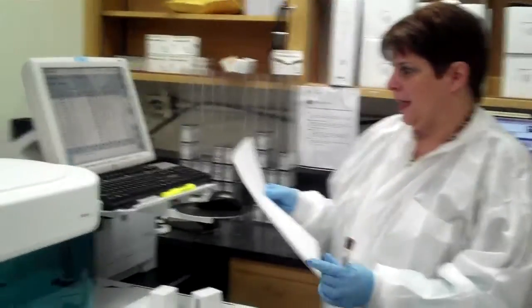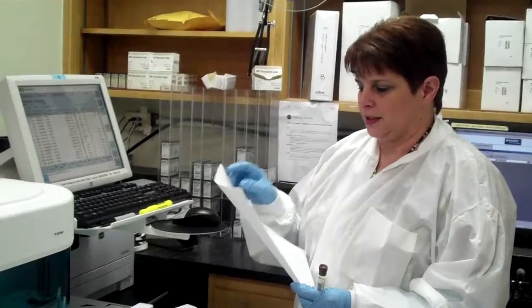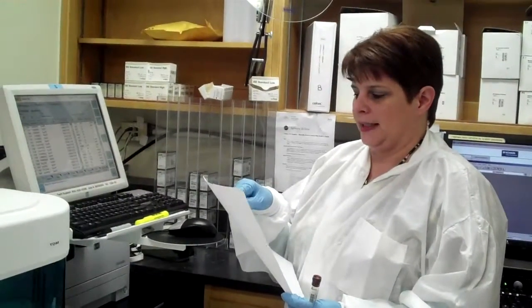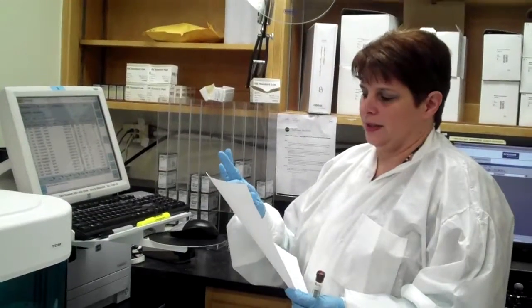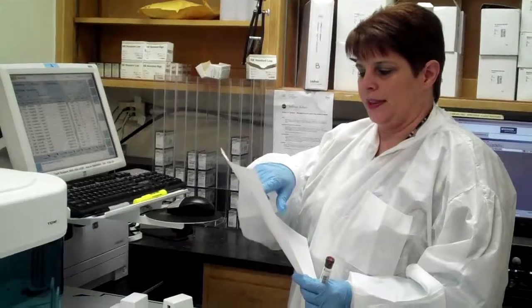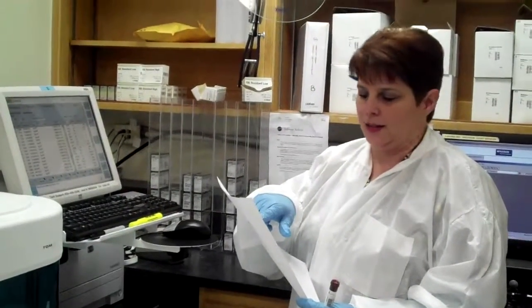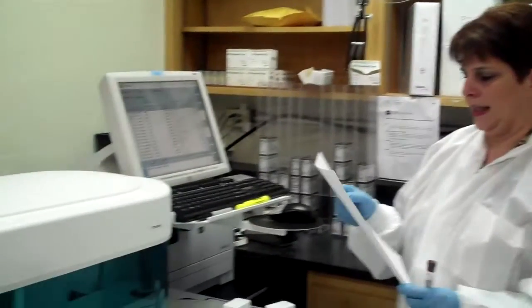Top part, and it does all the basic chemistries to include the electrolytes, which are sodium, potassium, chloride, and carbon dioxide. That's the main things it does. It also does blood sugar or glucose. Probably heard that term. It does the kidney tests that are called BUN and creatinine. Those are kidney function indicators.